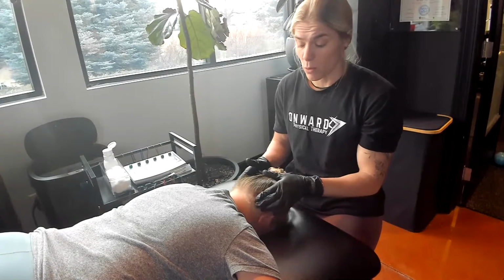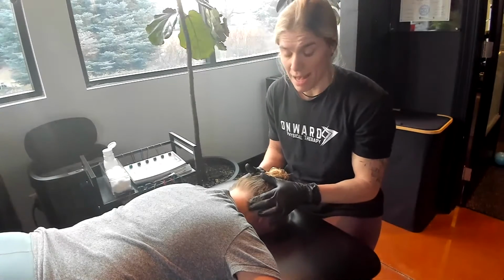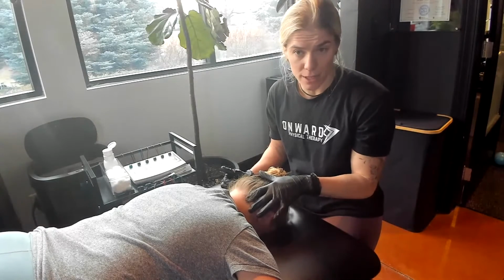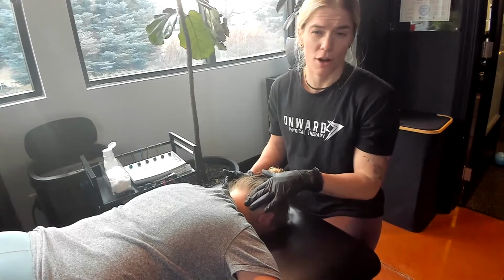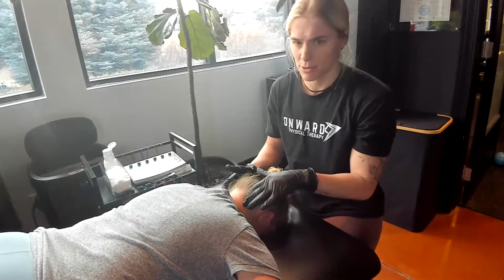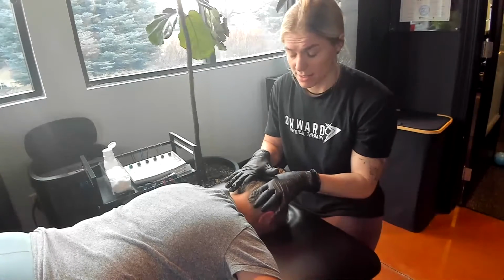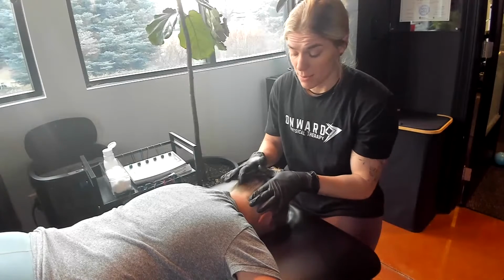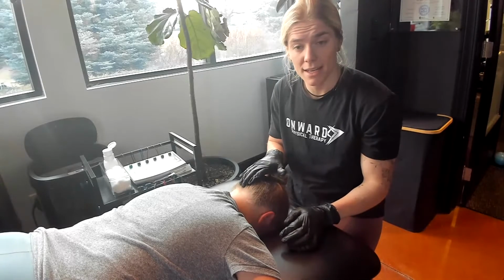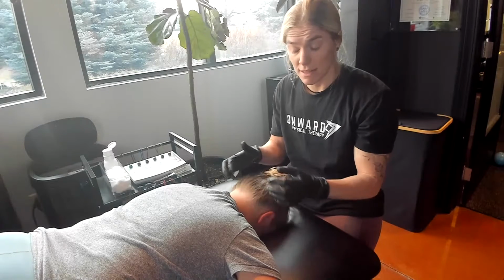There is an area we want to avoid in this region as well. If we find the mastoid process, about one finger breadth medial to that, there's a little sulcus. That sulcus is where the occipital artery lives. And if we go too deep there, we can interact with things like the vertebral artery and such. So we don't want to be interacting with that tissue there. It's pretty small territory here, but we are going to be keeping our needles about two finger breadths away from that EOP is where those needles are going to be living.